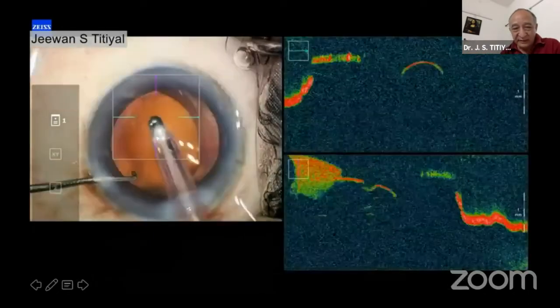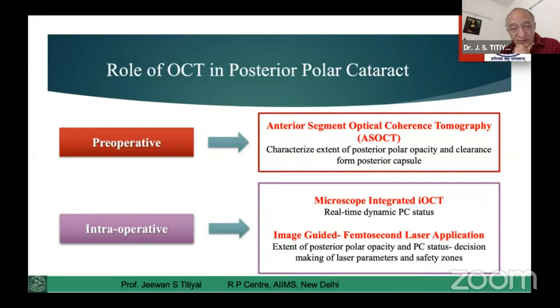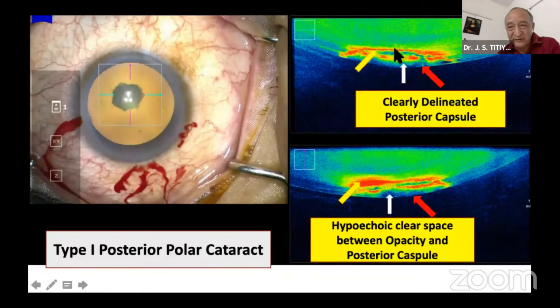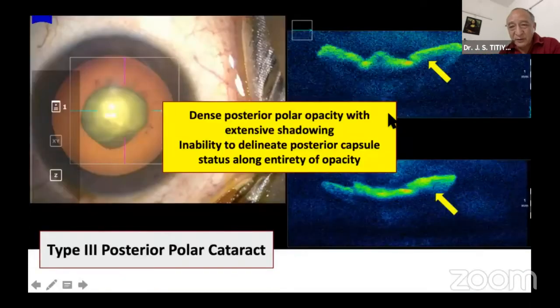There is a role for OCT assessment pre-operatively — like anterior segment OCT or good microscopic examination. If you have an iOCT-attached microscope, that will give much more information. This is our classification of three types of posterior polar cataract. In Type 1, you have a very nice disc seen and the central capsule can also be visualized apart from the disc. In Type 2, the central area is not visible but the periphery — you can still delineate the posterior capsule apart from the disc size.